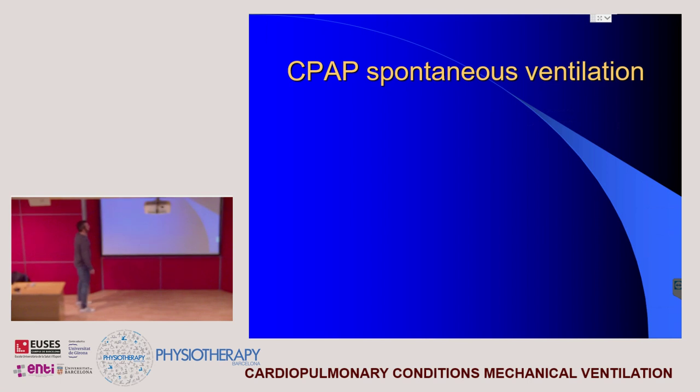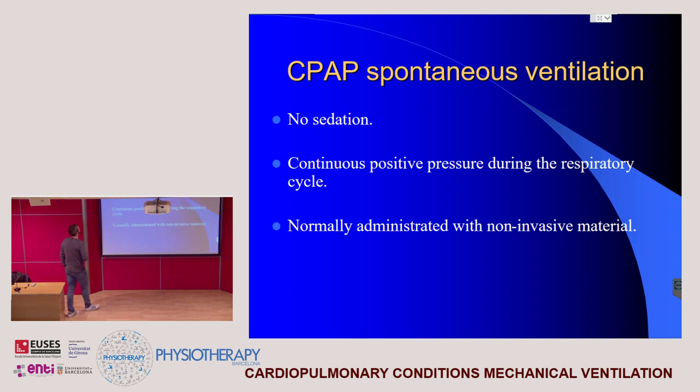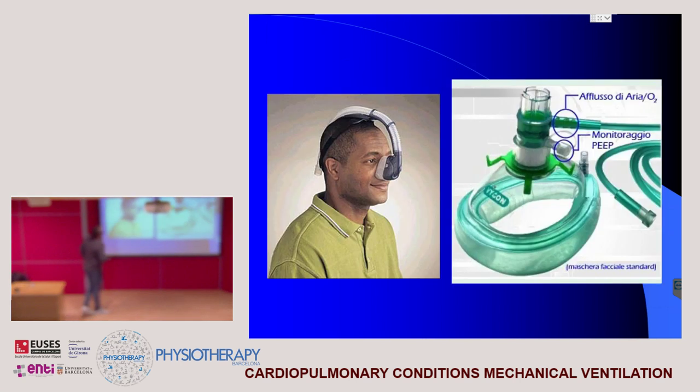As I said, the other modes of ventilation I will pass very quickly, because we have talked about CPAP ventilation, and in fact it's not a real mode of ventilation. It's only a continuous positive pressure during the respiration. And if you remember, we have talked about them with those kind of patients, the obstructive sleep apnea-hypopnea syndrome, and this is the gold standard treatment. It's CPAP.